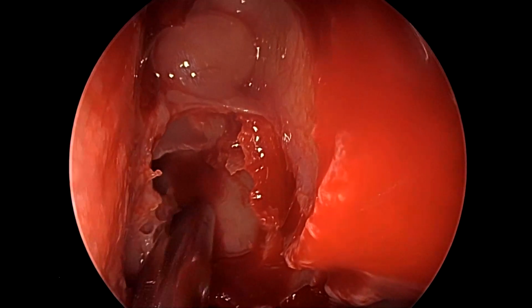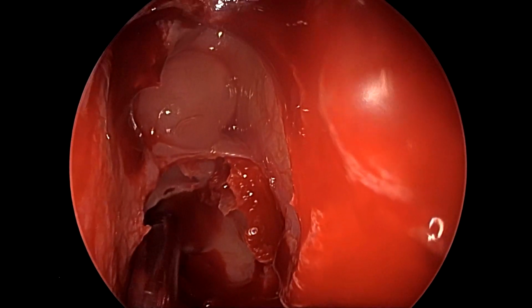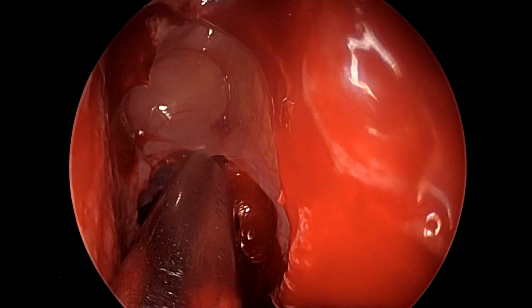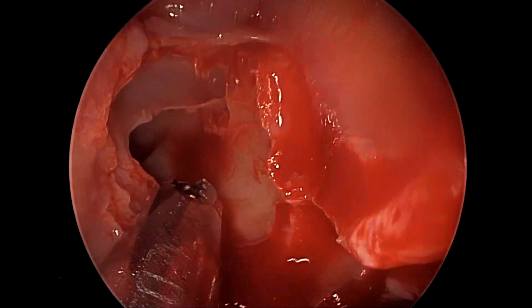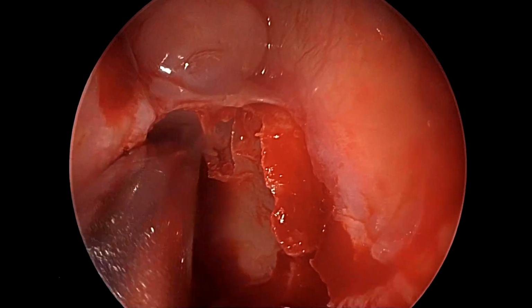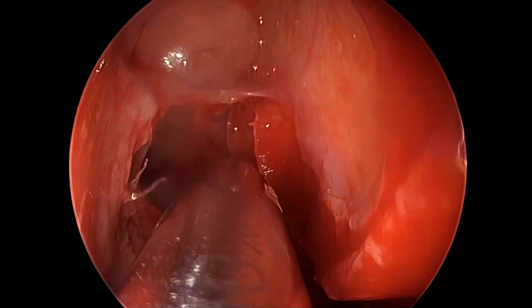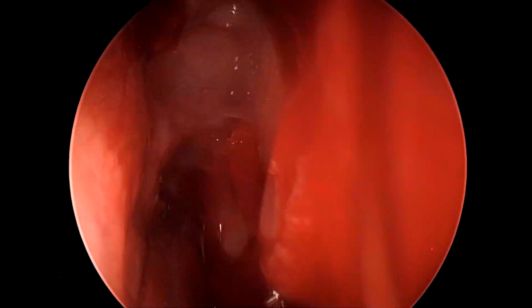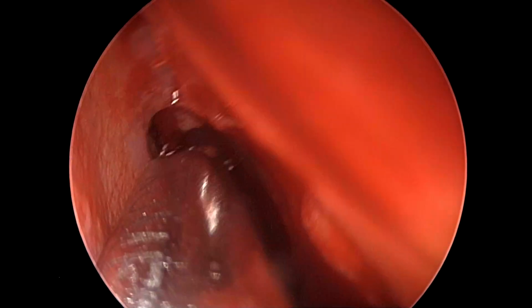What must be clearly understood is that one must definitely take some time in obtaining adequate exposure in this stage of the surgery, because any haste here or trying to plug the defect without creating adequate exposure and raw area has a much higher chance of failing eventually, and these failures are known to occur even in a delayed fashion. It may not be apparent initially as you have packs and gel foams in place, but after a few weeks this can turn out to be a failure if adequate preparation has not been created while operating.